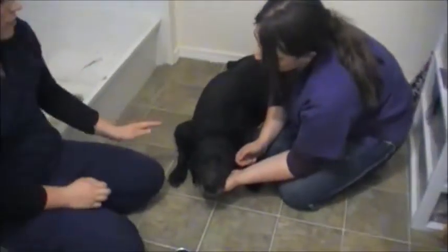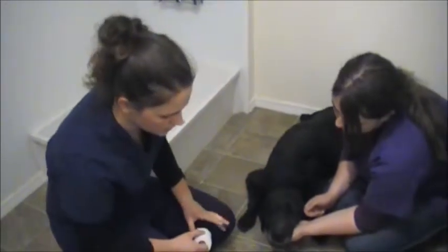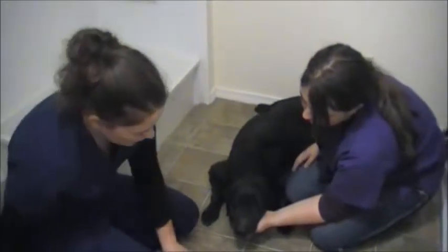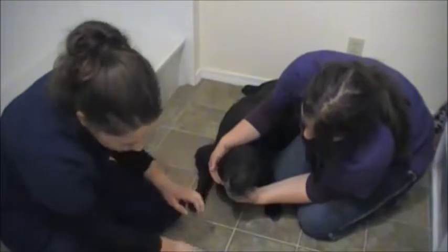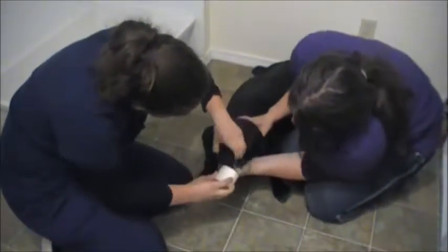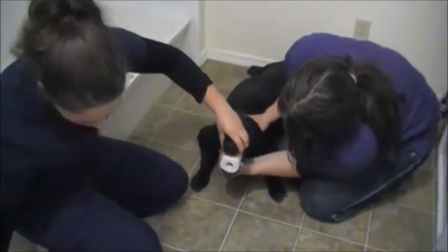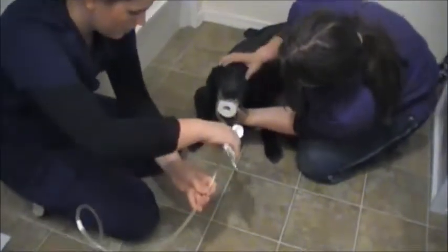So for placing a stomach tube, you want to do it either sternal recumbency or lateral recumbency. She's already laying sternal, so she's fine to stay just like that. And then I've got a roll of 2-inch tape that I'm going to use as a speculum. I'm just going to put this in the mouth so she can chew on that, and then I'll be able to pass the tube through the center of this roll. Okay, so I'll leave that in the mouth.